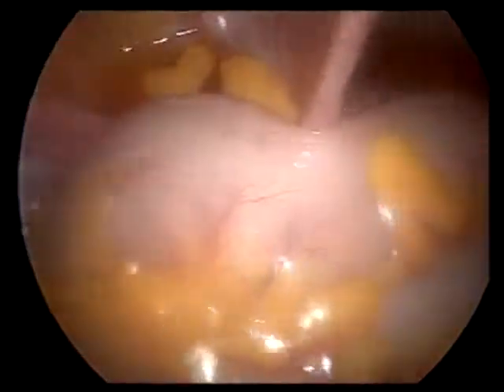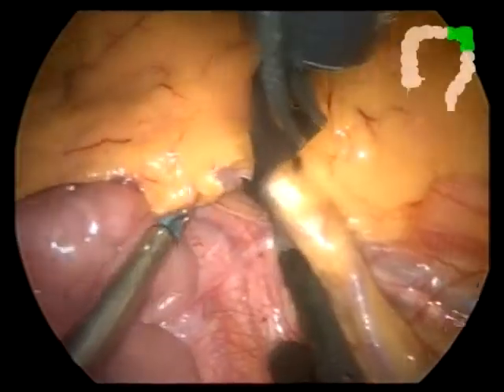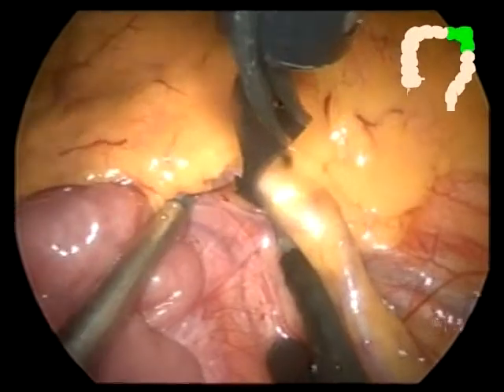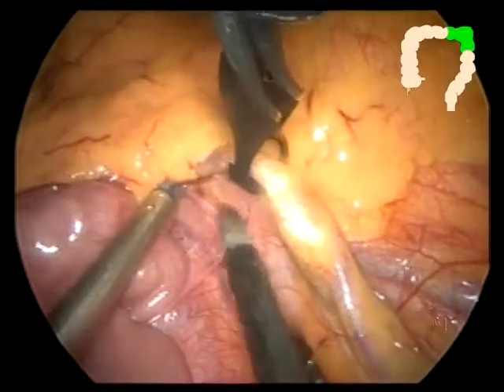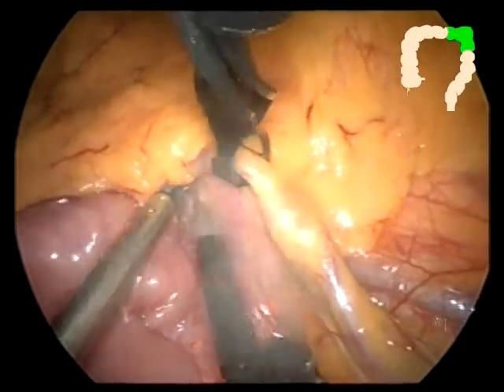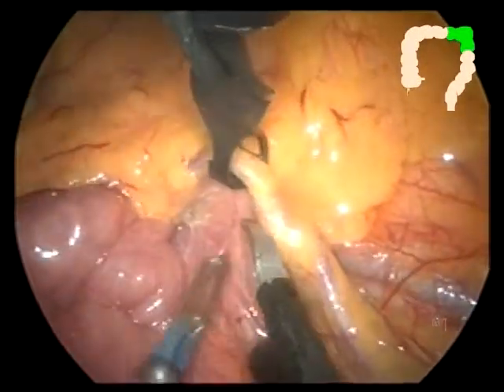After a routine abdominal cavity inspection, dissection starts from the inferior mesenteric vein, as we do for left hemicolectomy.